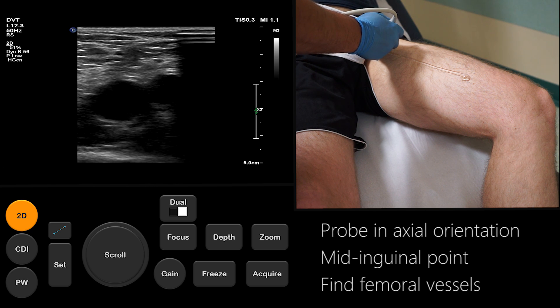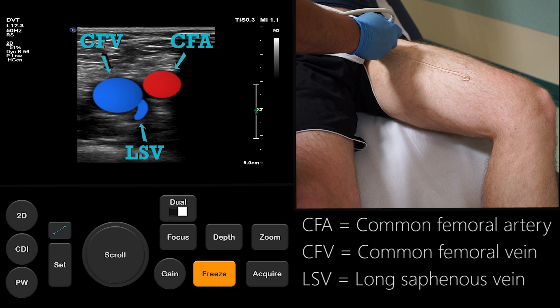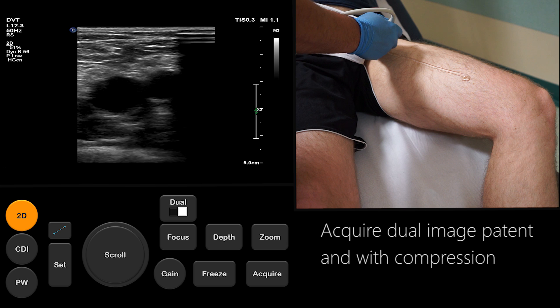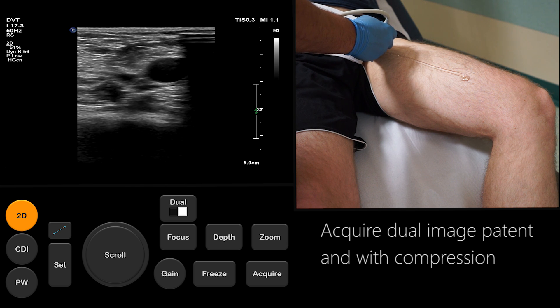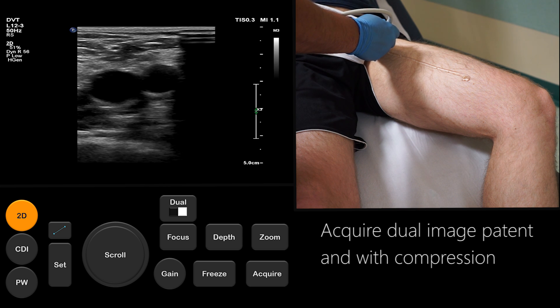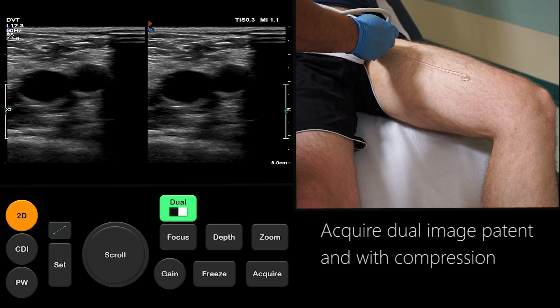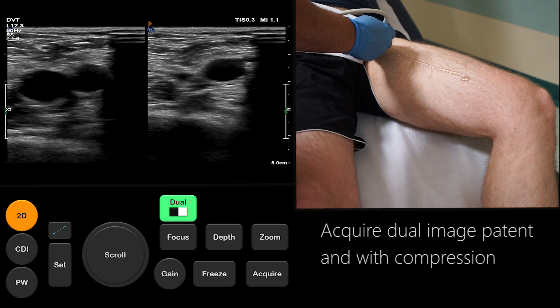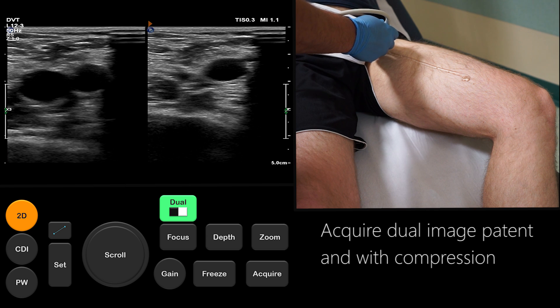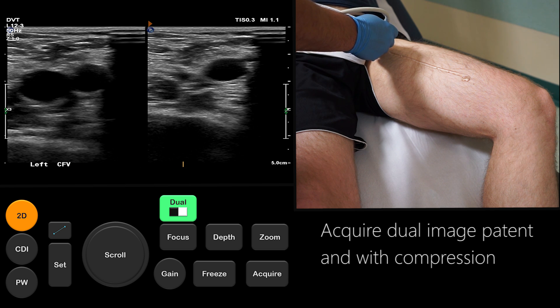To find the common femoral vein, we slide the probe proximally and tilt cranially until the entry point of the long saphenous vein is seen. Use the dual scanning mode to acquire an image of the CFV patent and with compression as demonstrated. A vein containing thrombus will not compress fully and may contain echogenic material. A fair amount of pressure is required to fully compress the CFV, so remember to inform the patient that the scan may be uncomfortable.